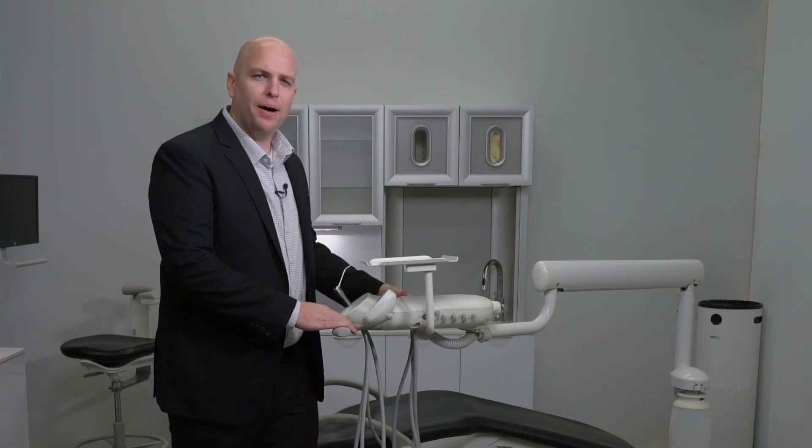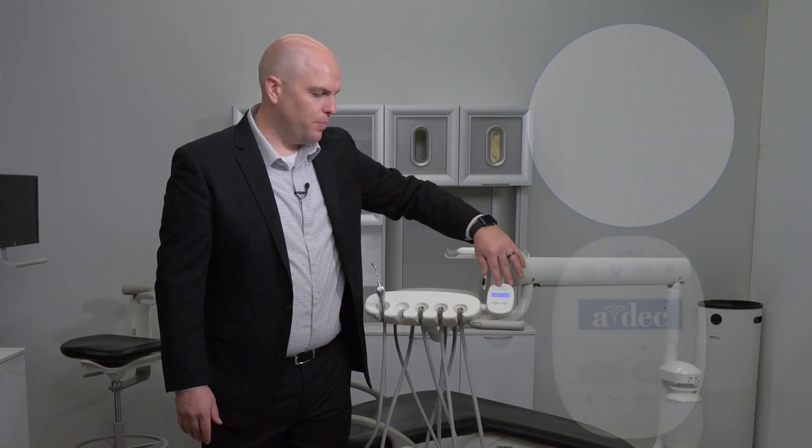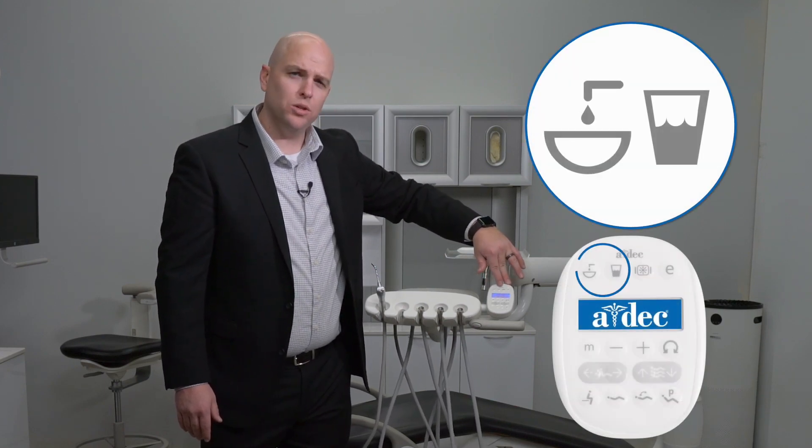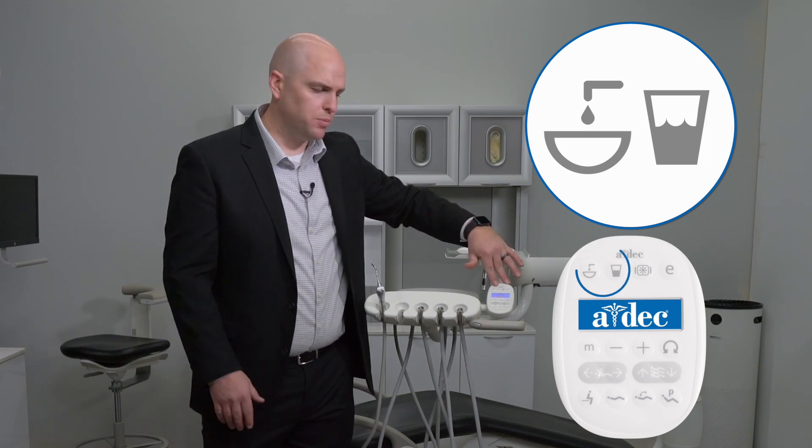Now let's talk about the touchpad. This ADEC 332 delivery system is configured with the 300 series deluxe touchpad. At the top of the unit, you'll find the auxiliary buttons — auxiliary one and auxiliary two. If you choose to have something connected to those, they will also control your cuspidor if you have one.